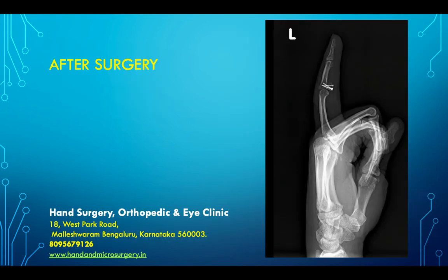This was the situation after surgery, wherein the volar lip of the middle phalanx was well restored, screws were in place, and the joint was also well aligned.